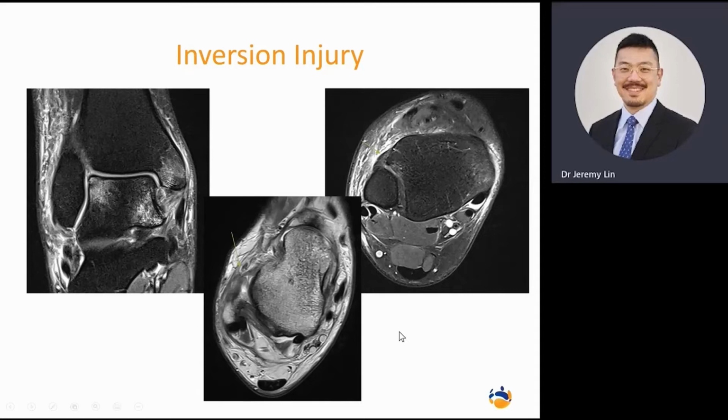It does save time, and it does mean that if there is, for example, a displaced osteochondral lesion, it saves time for them to go backwards and forwards, getting one study after the other. It saves time for you at the primary point of contact. They don't have to come back and say, my ankle still hurts, what's going on? It gives you the answer and gives you confidence about what to do next.